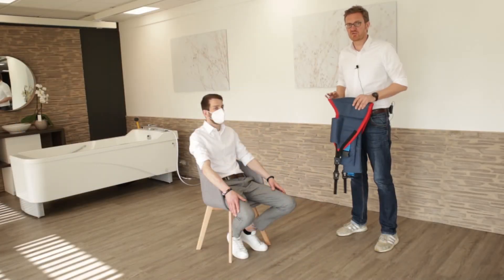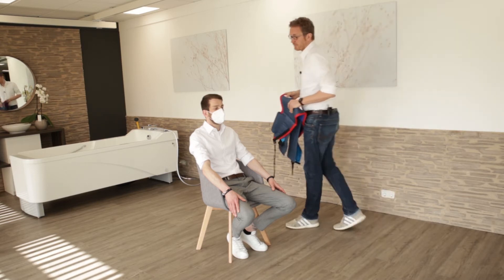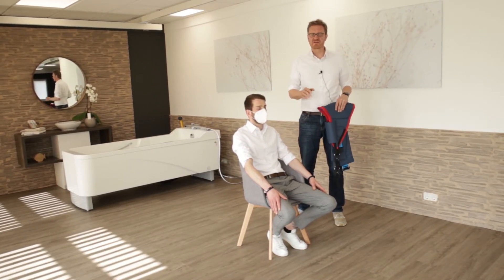I would like to demonstrate how to adjust the Nora Sling on our patient. The patient who fits best to the Nora is a patient who has semi-mobility left, so category three or maybe a category four.